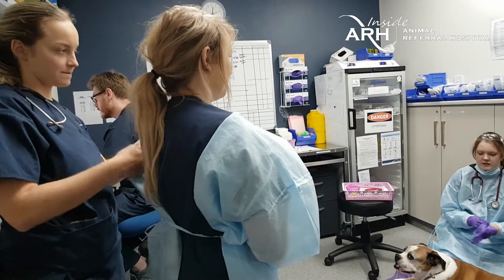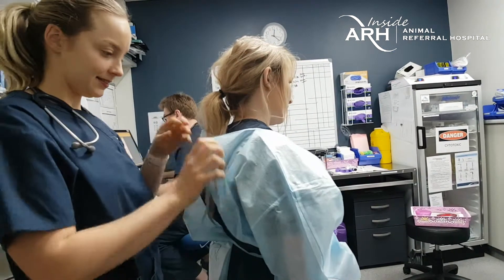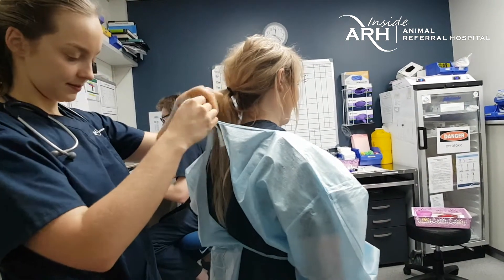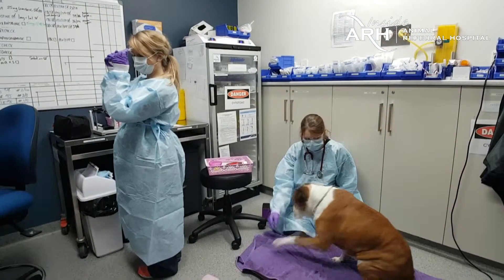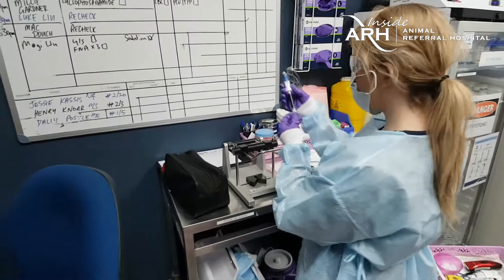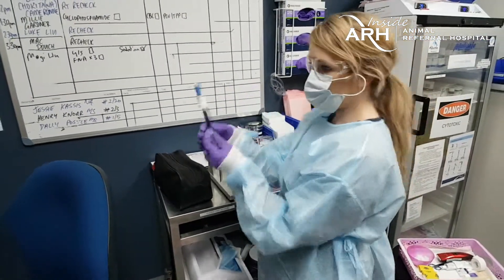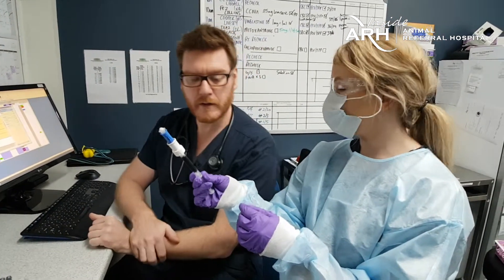Protective gear is being applied for the safety of personnel working with these chemotherapeutic agents, as they are toxic substances with potential hazardous health consequences. The dose is verified — two and a half mils. A redundancy of checks is performed to make sure that the dose delivered is the prescribed dose, as a quality control step in the whole process.